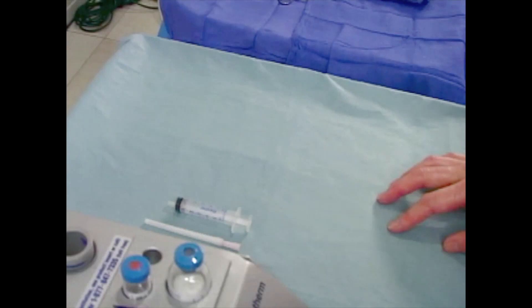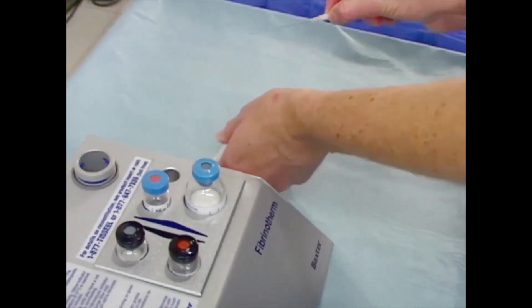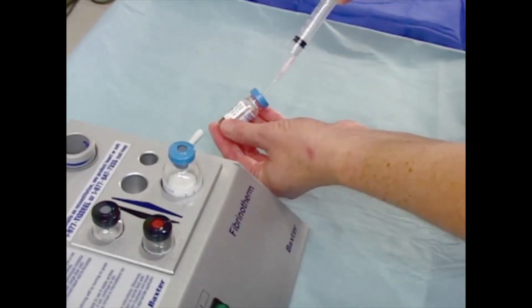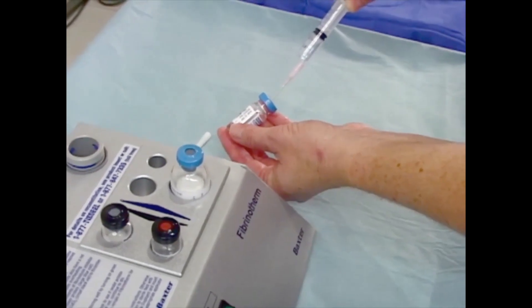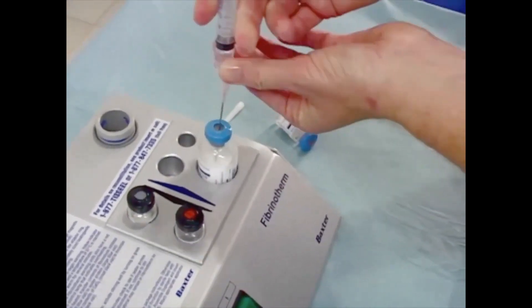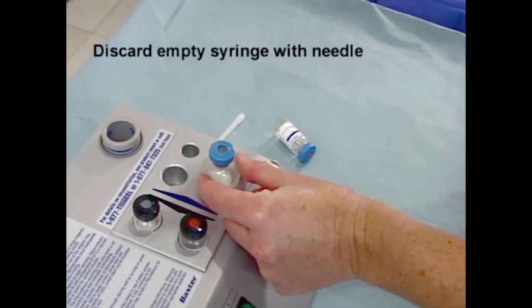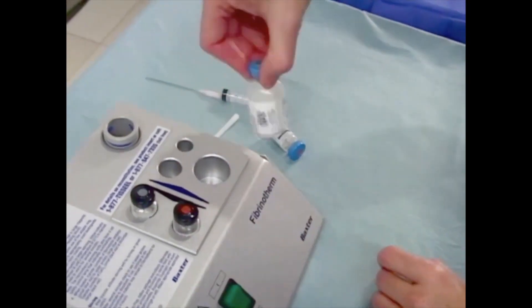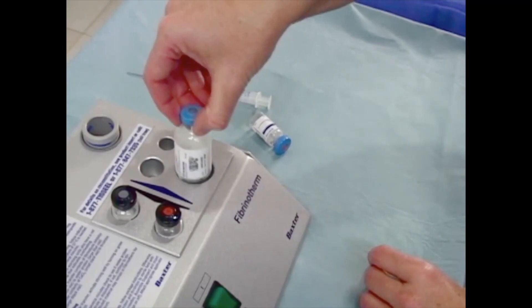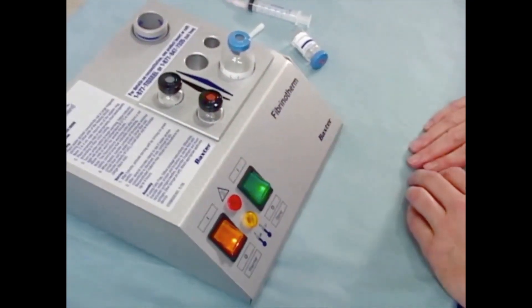Inject the blue-capped vial solution into the blue-capped vial powder. Transfer the fibrinolysis inhibitor solution into the vial containing the freeze-dried sealer protein concentrate. Using a blue-scaled syringe, withdraw all the fibrinolysis inhibitor solution from its vial. Tilt the vial slightly to facilitate withdrawal of all the solution, but do not invert the vial or inject air into the vial. Next, inject all of the fibrinolysis inhibitor solution into the sealer protein vial. Do not invert the vial. Check the sealer protein vial to make sure that all of the sealer protein has been moistened. Gently swirl the vial to ensure that the freeze-dried material is soaked. Place the sealer protein vial back into the largest opening of the Fibrinotherm device with the appropriate adapter, if needed, and activate the magnetic stirring by pressing the green switch.